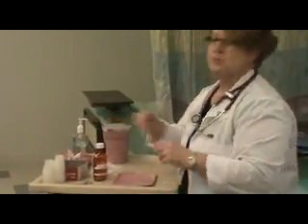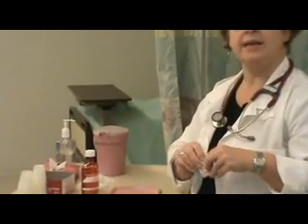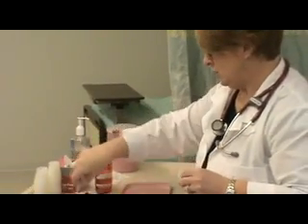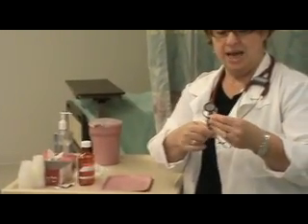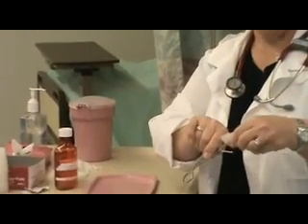Now, when I crush medications, there are times when the coating on the outside of the tablet is made of some sort of plastic or some sort of thing that won't crush. So what I like to do is keep my hemostat handy so that I can pluck out the pieces that will probably not fit through the G-tube without clogging it.